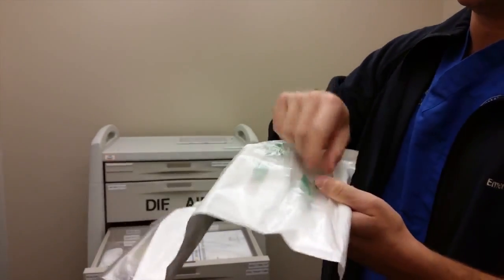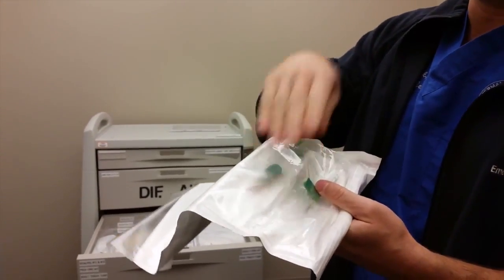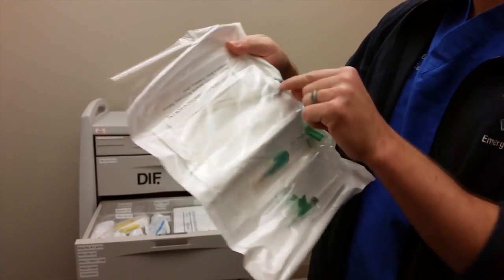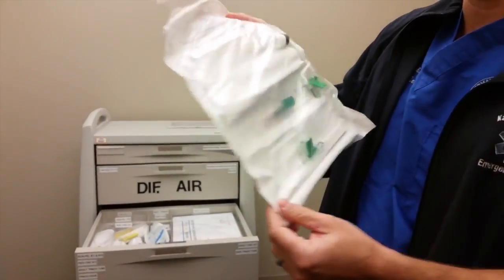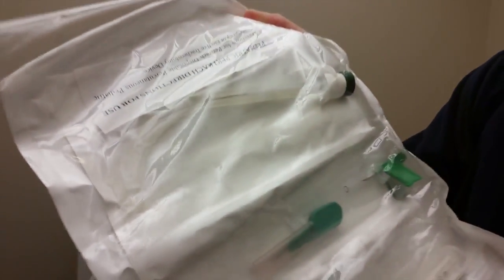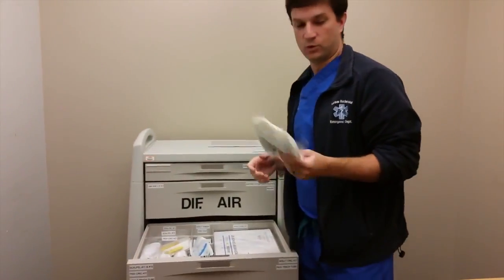And then you take the guide wire, you take the dilator out, you leave the guide wire in there, and pass your little tiny trach tube in. Okay, so you can see it's hard to totally see it, but there's a wire and there's a little tiny tube in there, top there. So it's actually pretty quick though to use this.